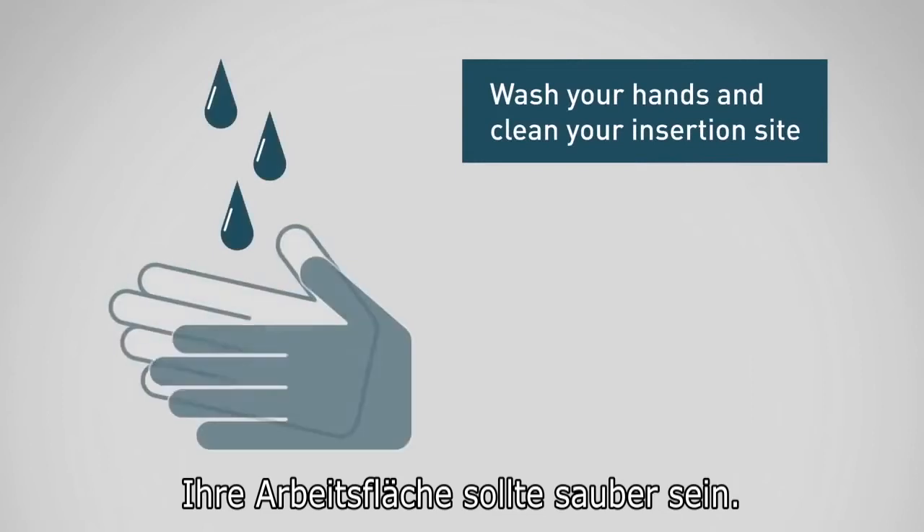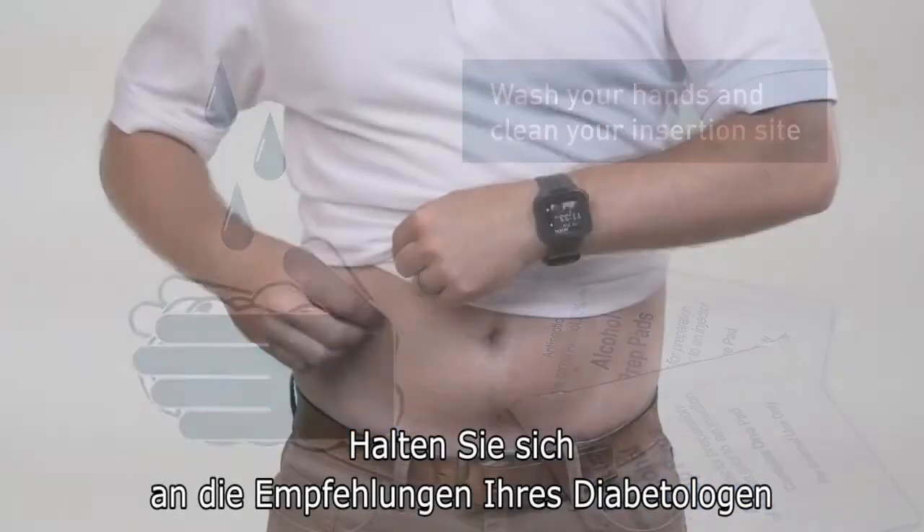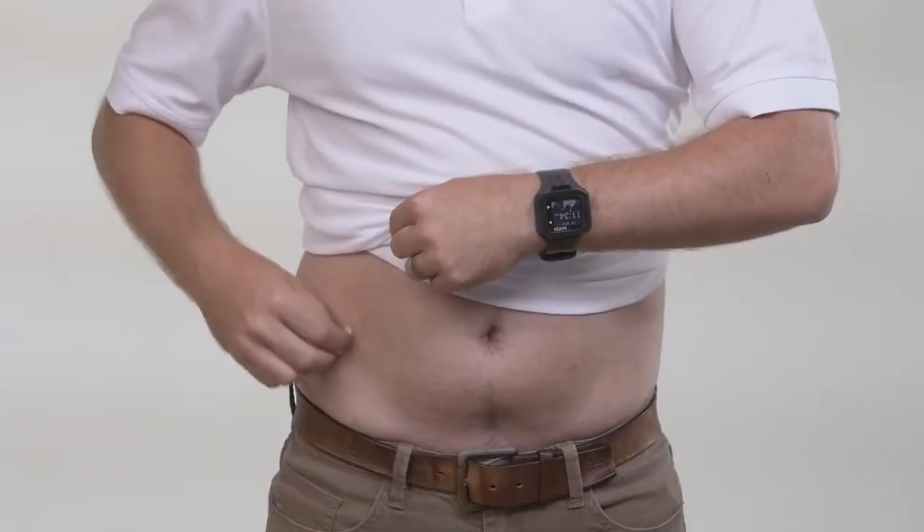To begin, you will want to work on a clean surface. Be sure to wash your hands and clean your insertion site. Please refer to your healthcare provider's recommendations when selecting an insertion site.